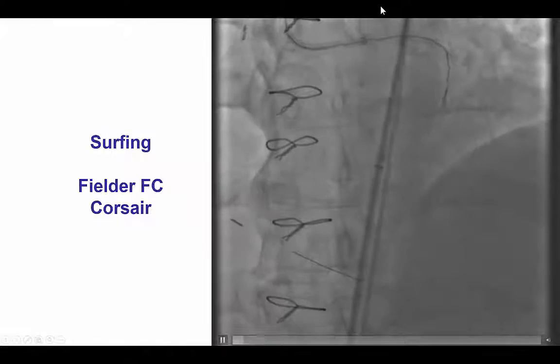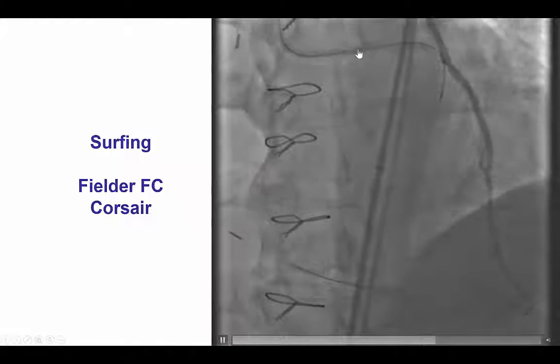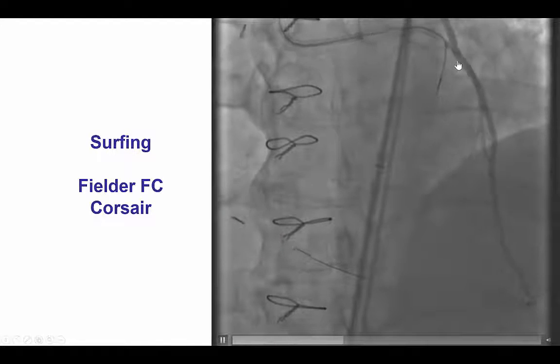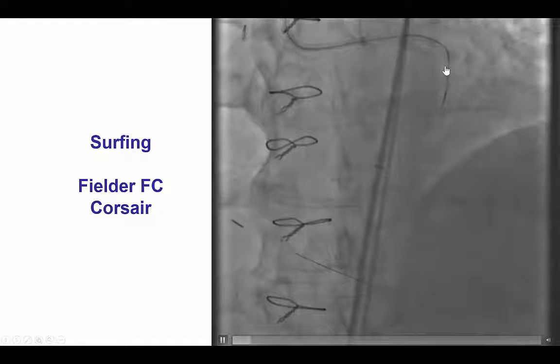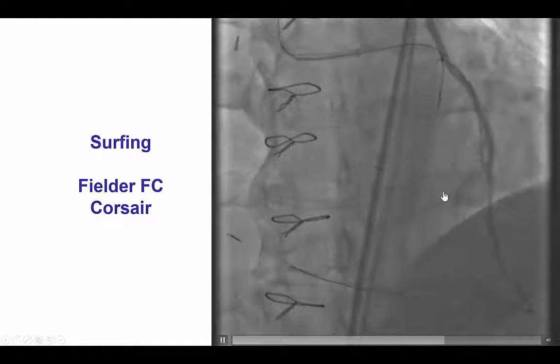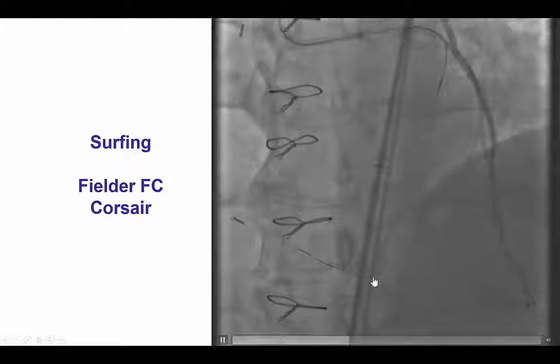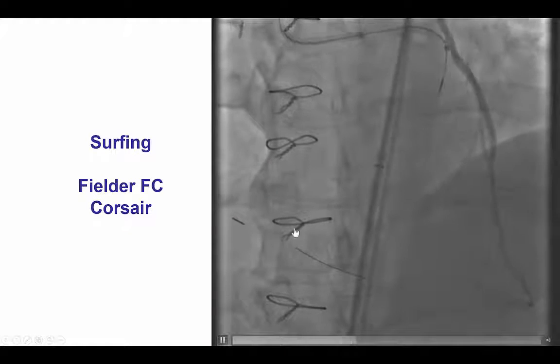We performed dual injection from the LIMA as well as the left main, and by visualizing from the LIMA, we were able to surf through a septal collateral with a Fielder FC guidewire that advanced easily into the posterior descending artery.